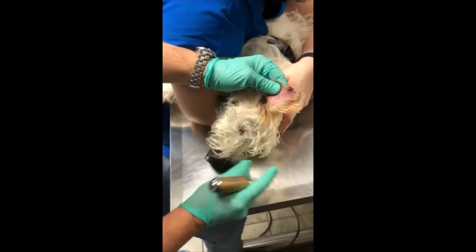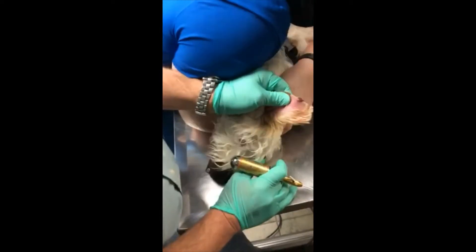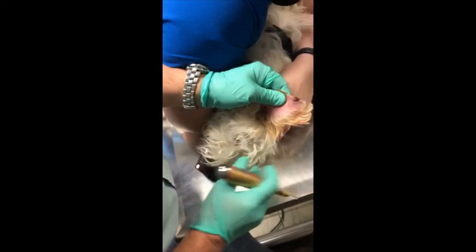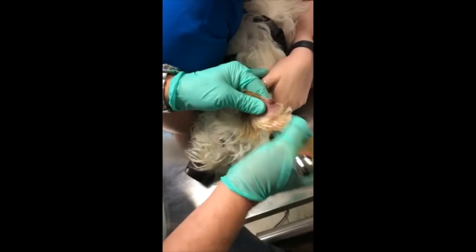This is Doogie. He's a year and a half old wire hair Jack Russell. The reason for the significant restraint and the muzzle has nothing to do with the freezing procedure — it's entirely due to his temperament.